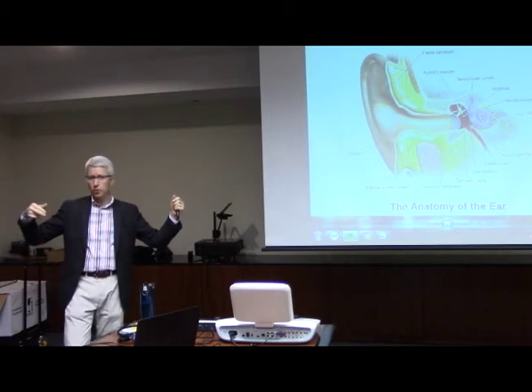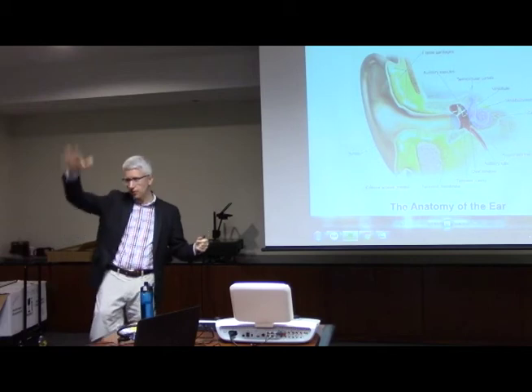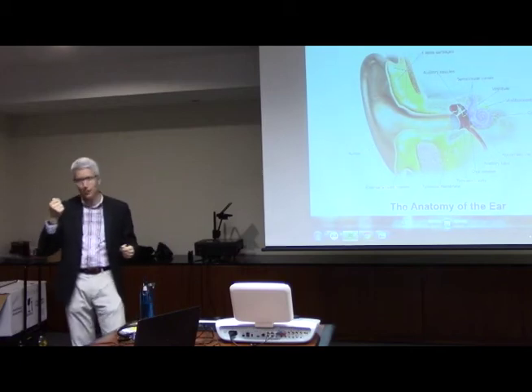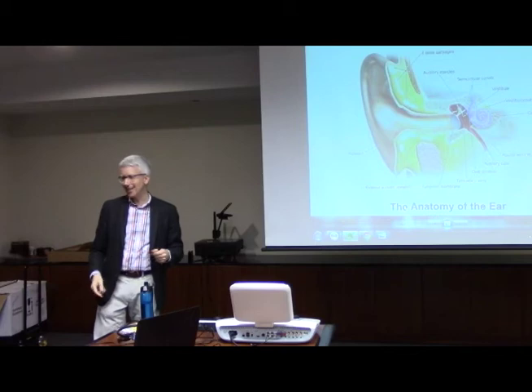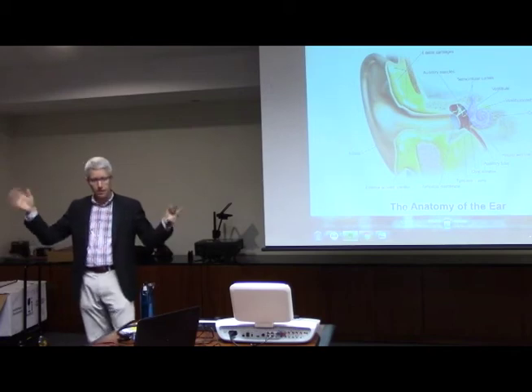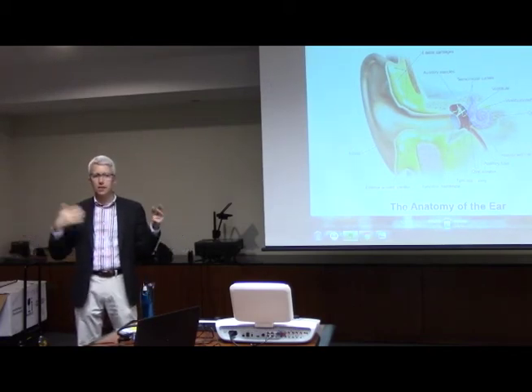Speakers are usually used when testing kids. So if you have a kid who isn't old enough yet to raise their hand or push a button, at least when they're supposed to, because they like to sit there and push a button. Yeah, they're good at pushing the button. It's when they're supposed to, that's the picky part. Chewing on the button. Oh, all kinds of stuff. Well, kids walk in, they see a whole bunch of red and blue, and they start grabbing it. But with the speakers, when you're testing little kids, we'll use visual reinforcement audiometry or sometimes conditioned play.